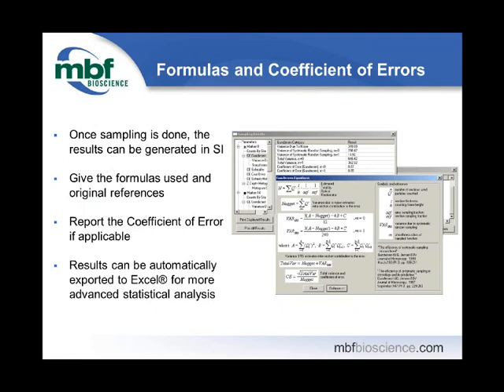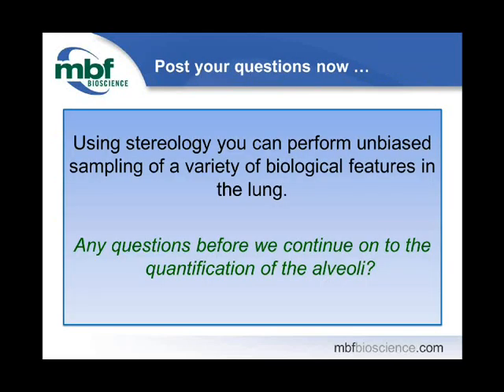Thanks a lot for your attention on this first part of the talk, where I just gave a broad overview of some of these probes. Now I'd like to introduce my colleague, Masha, who's going to give a more specific, in-depth example of how to estimate the number of alveoli. Before we do that, I'd like to take a pause and see if we have any questions about my part.